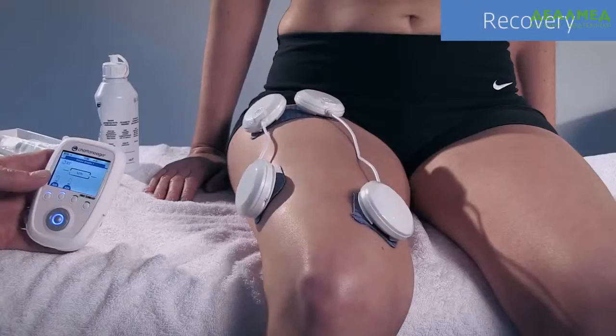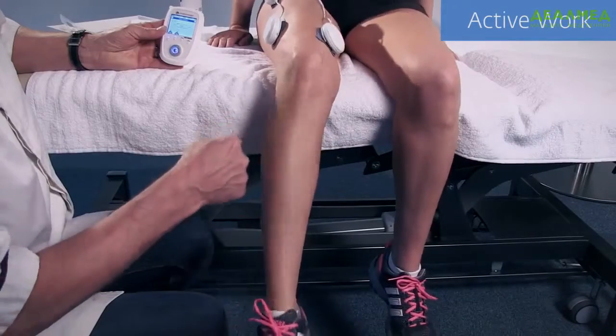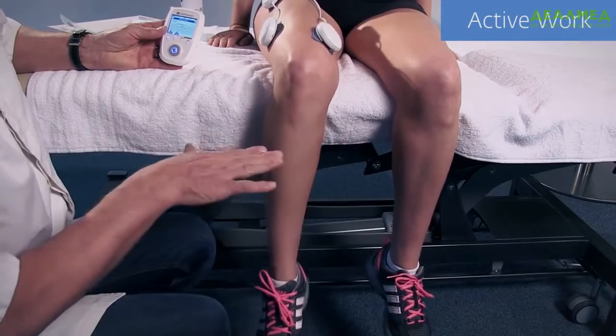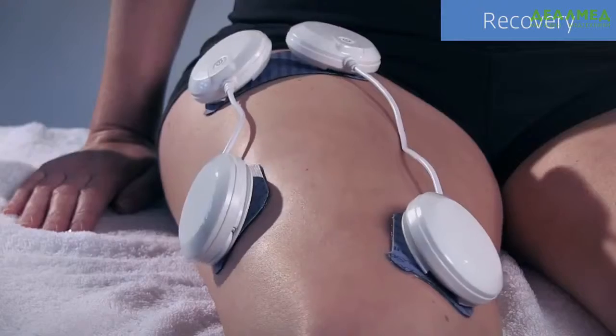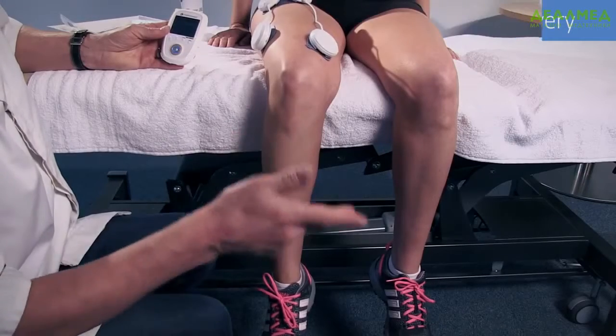It is generally recommended that treated limbs are not taken into full extension to ensure maximum comfort. Active work can be done using open chain or closed exercises, and programs comprise varying lengths of work and recovery depending on the one selected.